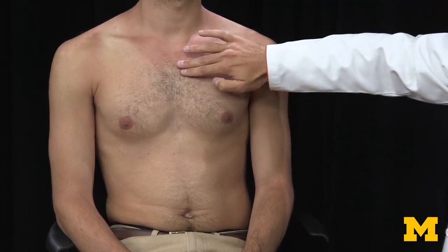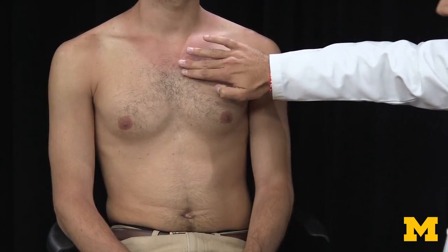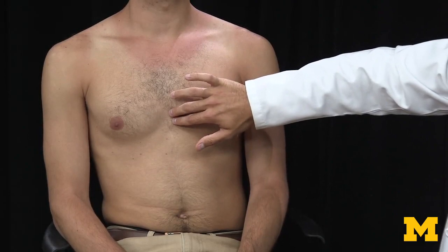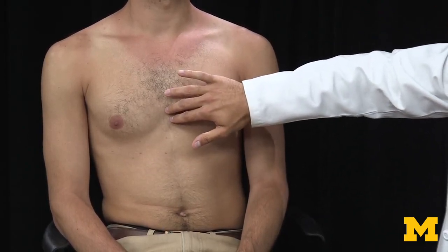Next is the tricuspid valve. I remember it as 'tri-cuspid' being the right AV valve, but you listen to it on the left side of the chest. Starting from the sternal angle just below the pulmonary position, the tricuspid valve is at the fourth or fifth intercostal space on the left sternal border. As an AV valve, it is S1-heavy: LUB-dub, lub-dub. That's a subtle difference from the aortic and pulmonary sounds, and it takes practice to distinguish, but you'll detect it in a clinical setting.